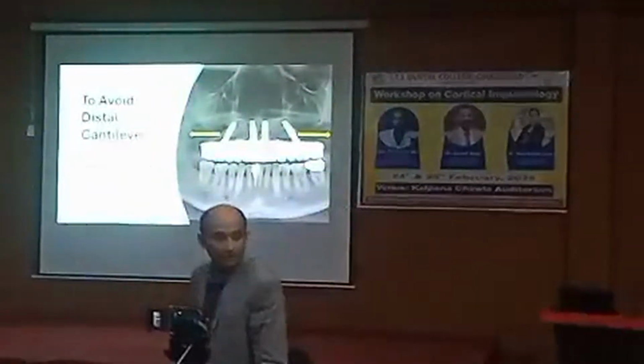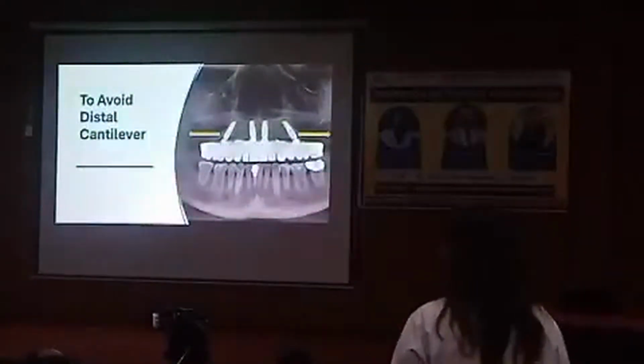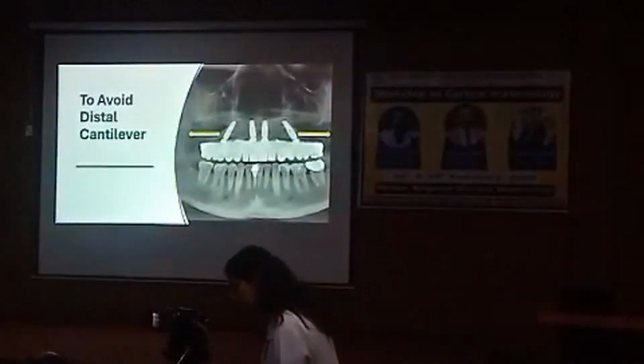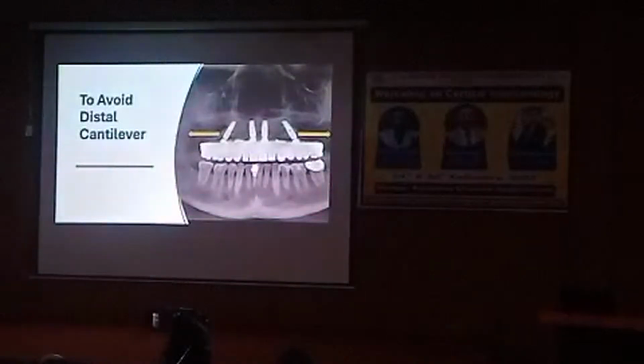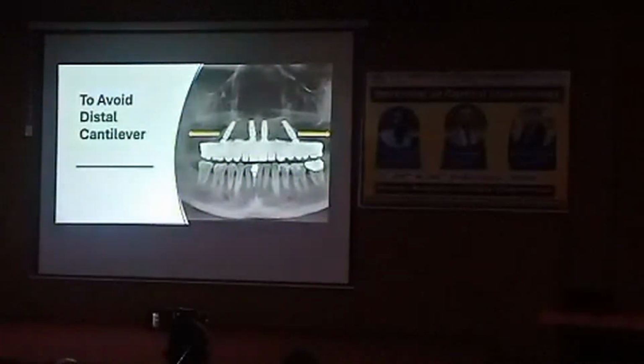So, in full mouth cases, the distal cantilever increases the occlusal load on the anterior implants. Technically, it will lead to crestal loss in the distalmost implant placed. So, this type of case has less longevity. We always ask what the rate of success is. If we give a distal cantilever and we load the cantilevers, it is not going to be a successful case for a longer period.